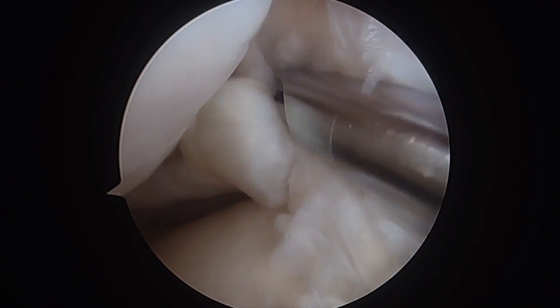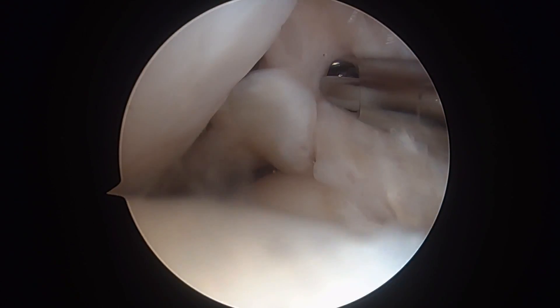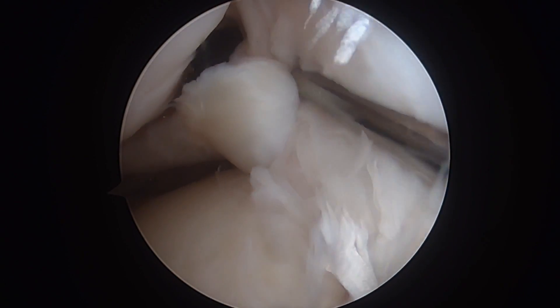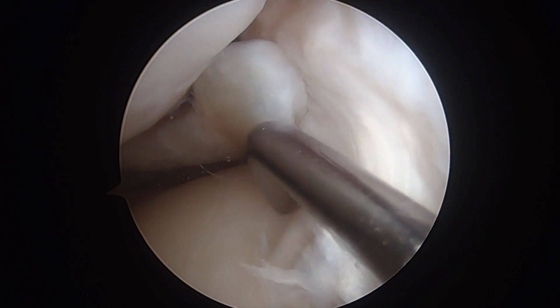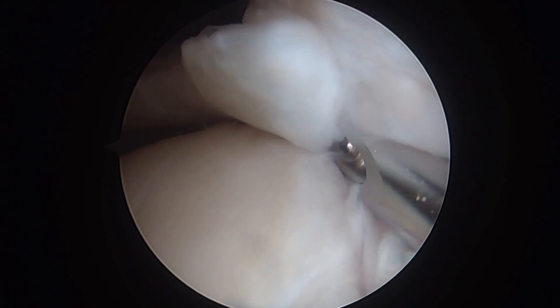The following is a surgical video of a 32-year-old gentleman who underwent ACL reconstruction by another physician and continued to have lateral and posterolateral knee pain. His MRI was felt to be inconclusive for lateral meniscal pathology. At the time of arthroscopy, the patient's ACL graft was noted to be intact, and a complete avulsion of the posterior root of the lateral meniscus was encountered. In addition, evidence of a partial prior meniscectomy of the posterior horn was seen. The terminal end of the lateral meniscus was noted to be completely avulsed from its native insertion on the tibia.